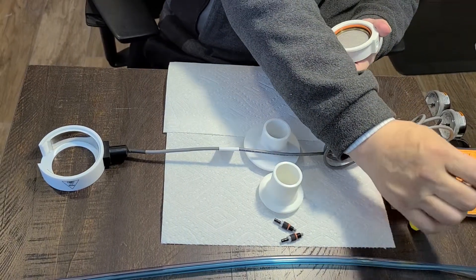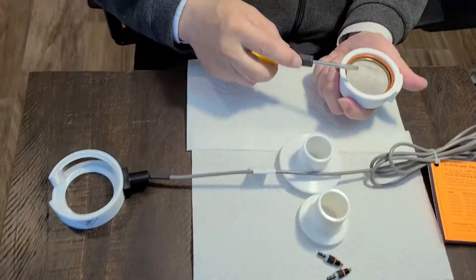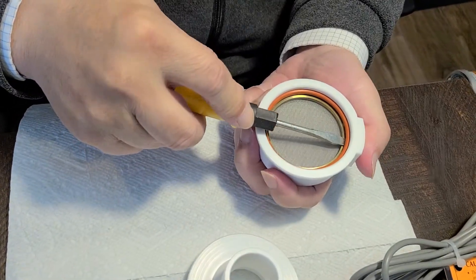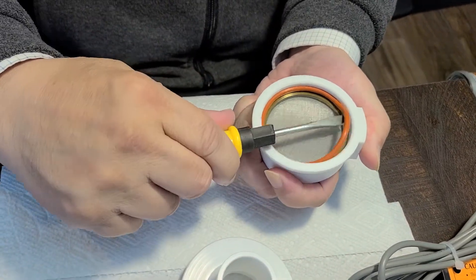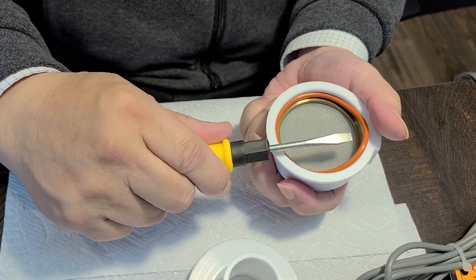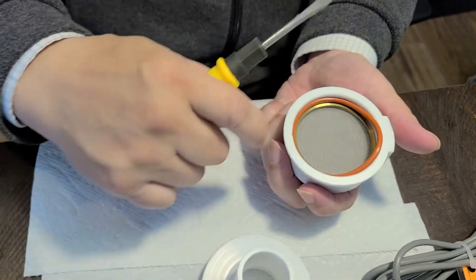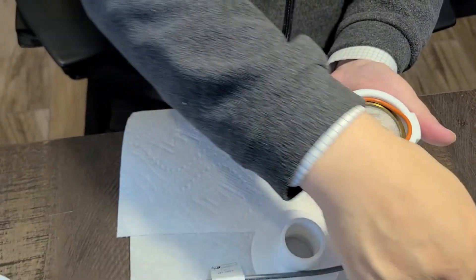Now we use a flathead screwdriver to remove the o-ring from under. Do not use a fingernail because you will hit the screen.